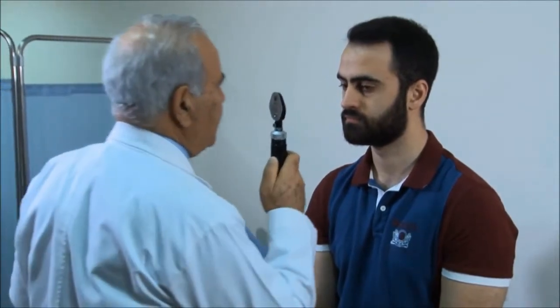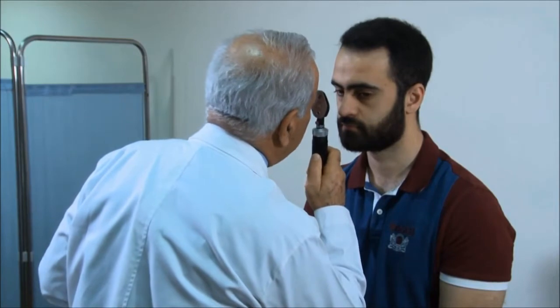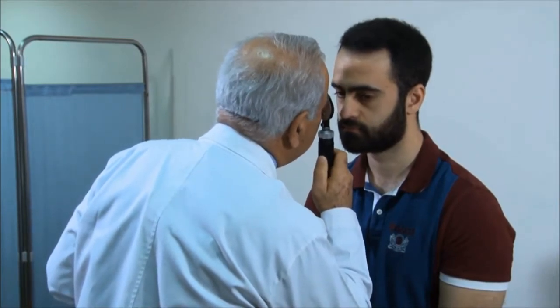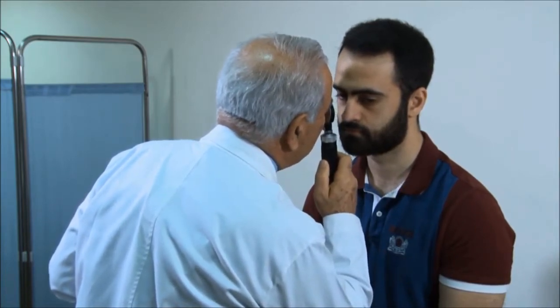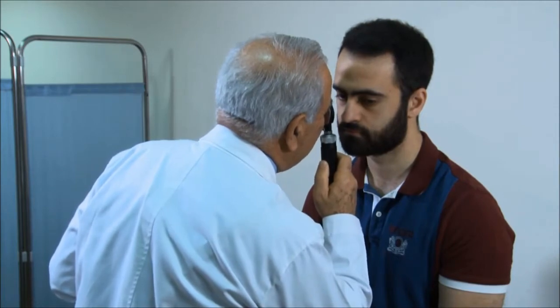The third component of testing the optic nerve is the fundoscopic examination. Using the ophthalmoscope with the right eye to examine the patient's right eye, keeping your mouth away from the patient's face, look inside the fundus to examine the vessels and the disc — noting whether it is flat and normal or shows papilledema. Repeat the same procedure on the left eye using your left eye and holding the equipment in your left hand.